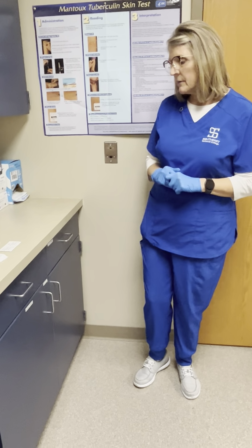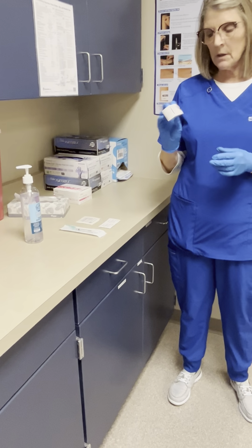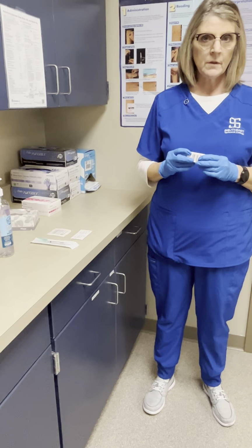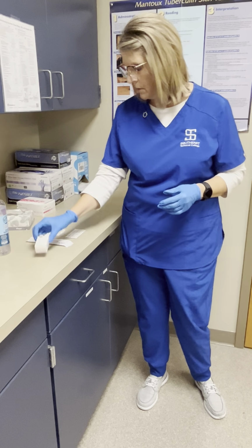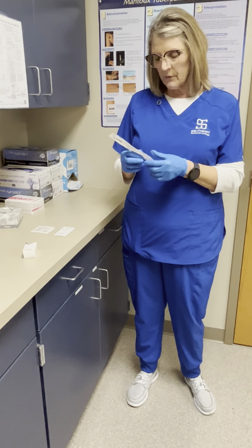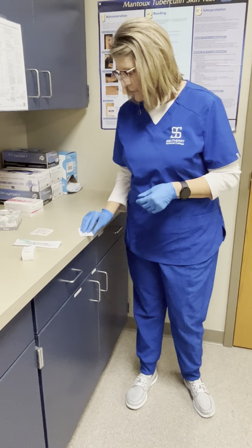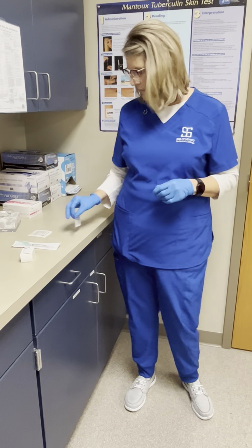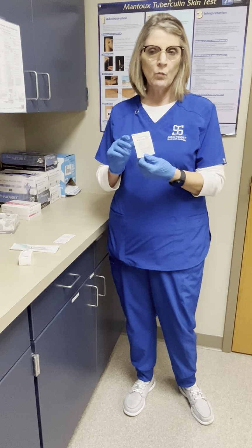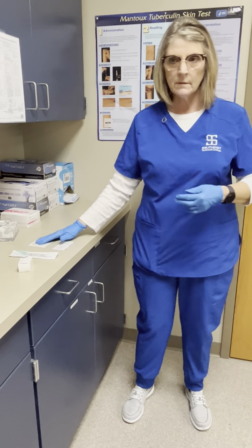Some of the supplies that we're going to use today are the TB testing solution. In our case, we're going to use Tubersol, but there are other brands out there that can be used. We're going to use a TB syringe, which has a smaller barrel and a smaller needle, two alcohol prep pads, and a sponge gauze pad for wiping off any fluid or blood that may come out of the injection at the end.